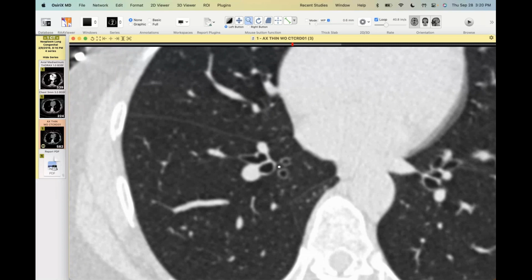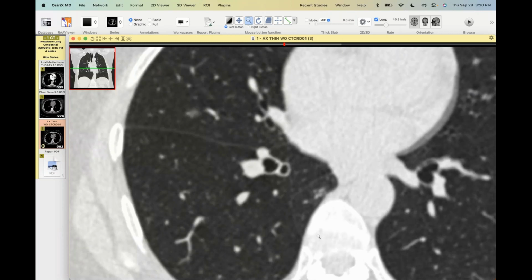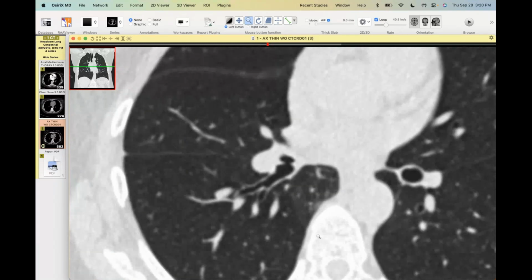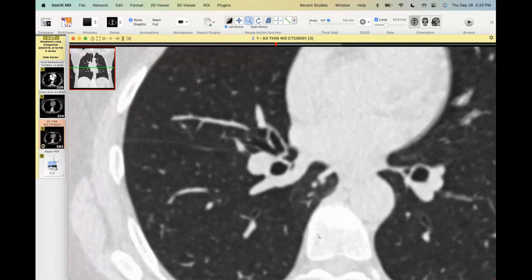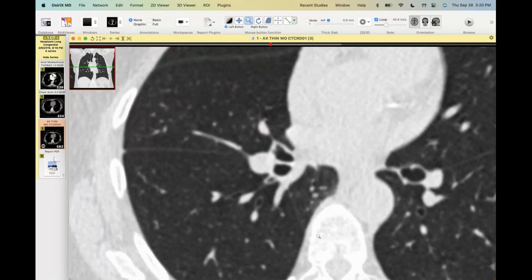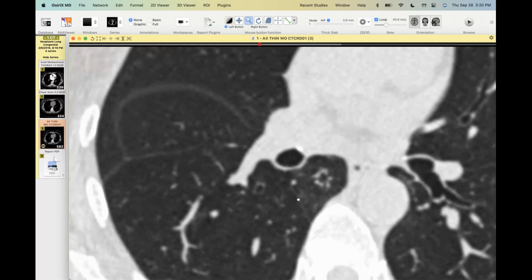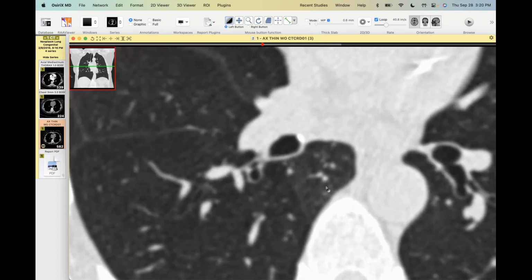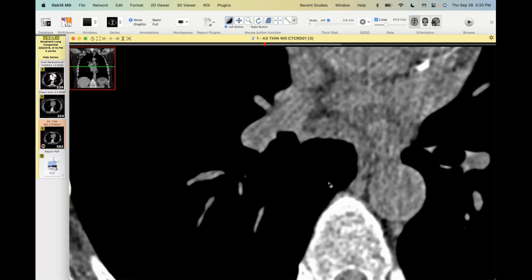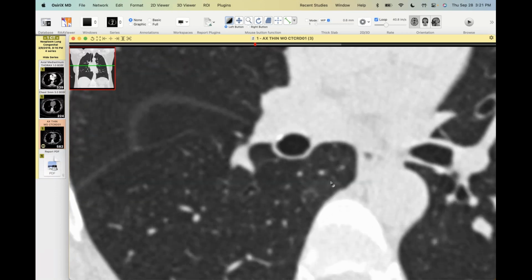Yeah, that medial location. Sequestrations don't have a fissure that defines them. So I think this is an attempted, you know, and it doesn't seem to have an airway, does it? Did they find an airway in it? I'll bet you they didn't. No, I actually think they didn't comment on it, David. I actually think this may be an airway right here that's just got a little bit of chronic mucoid impaction or something leading to a little higher attenuation. It's calcified there, but it doesn't go anywhere proximally. So what do you think that is?